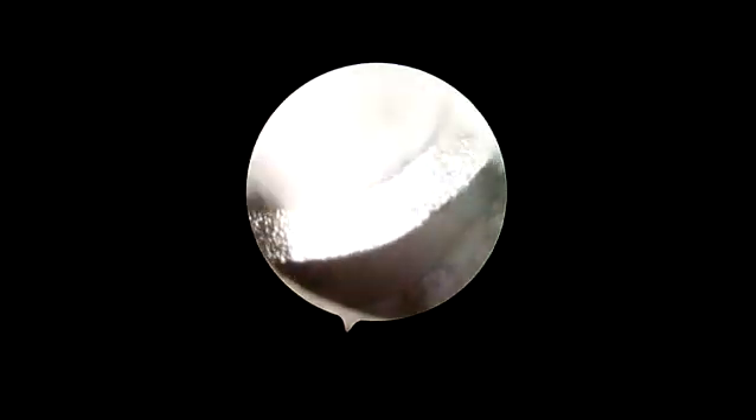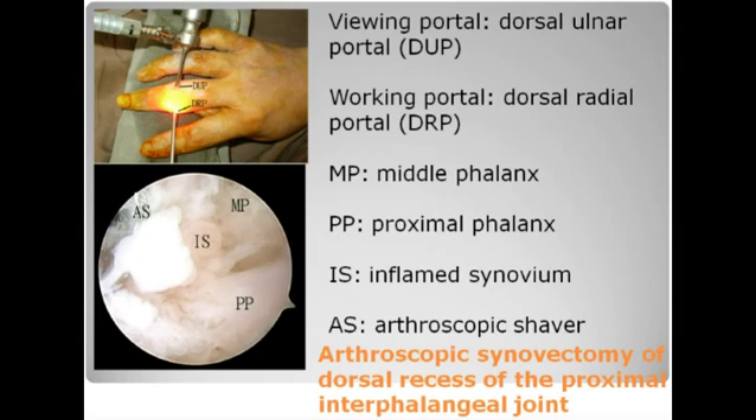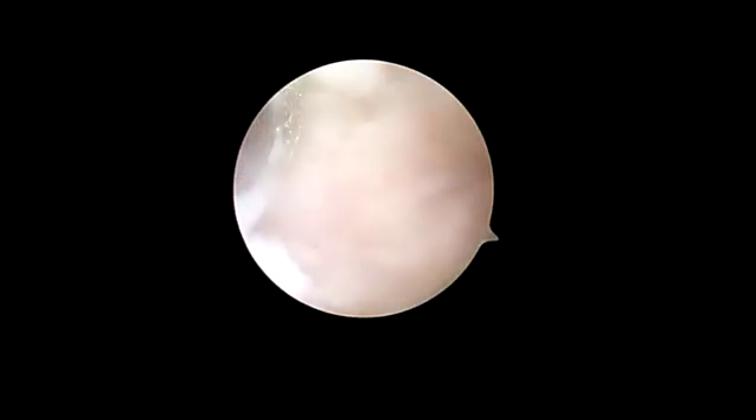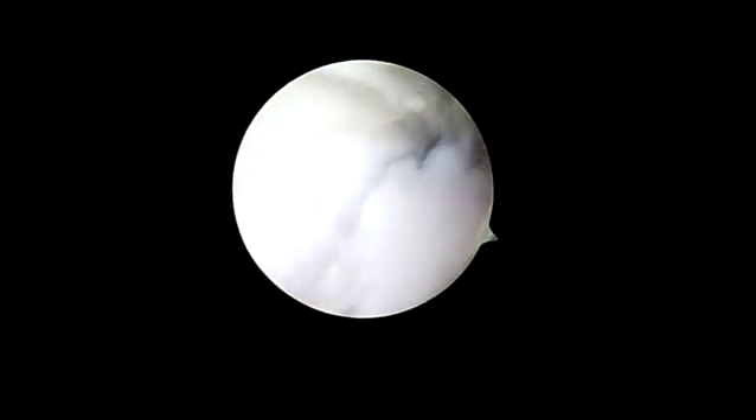Arthroscopy of the proximal interphalangeal joint is started at the dorsal recess of the joint. The dorsal radial and dorsal ulnar portals are interchangeable as the viewing and working portals. A complete arthroscopic synovectomy of the dorsal recess is then performed.